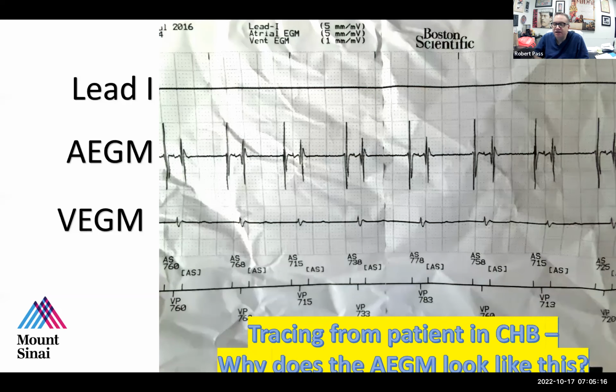So Maya, any thoughts on why we might be seeing this very large signal that seems to be right on time with the ventricular electrogram? Tarek correctly noted that it appeared as if there was a signal there.